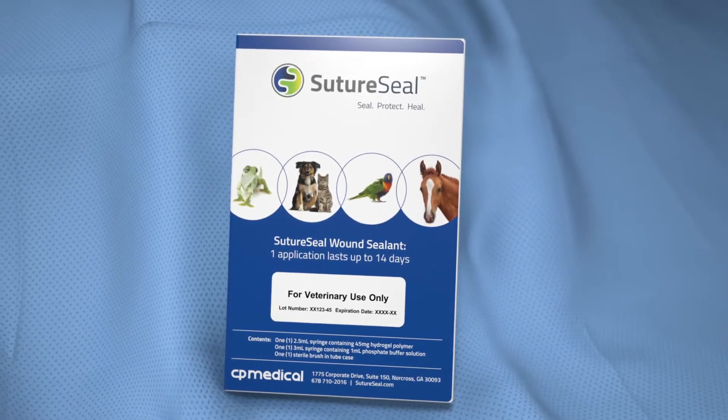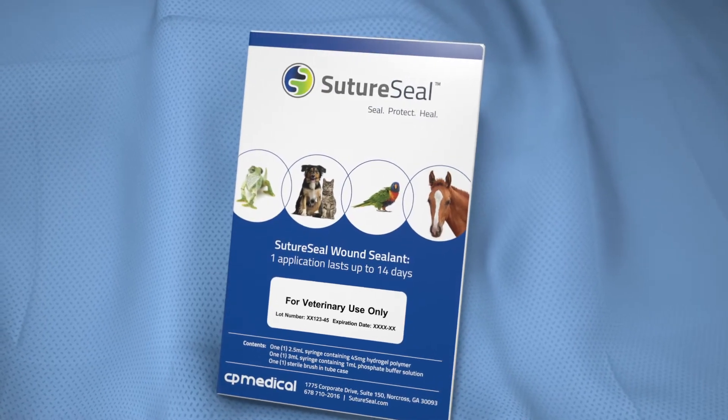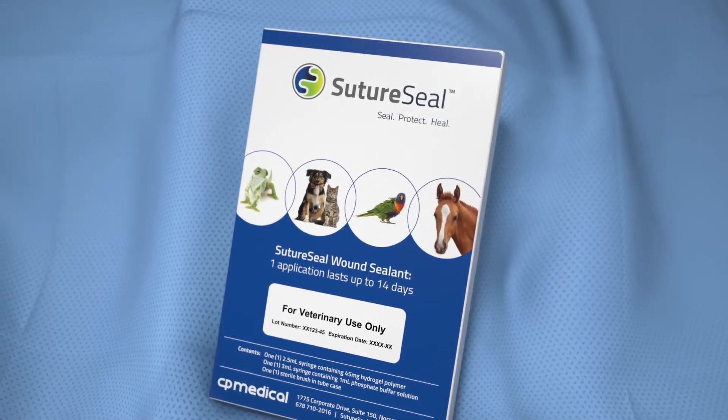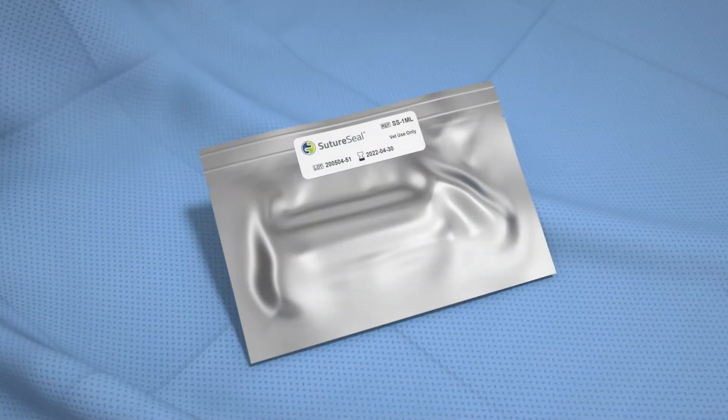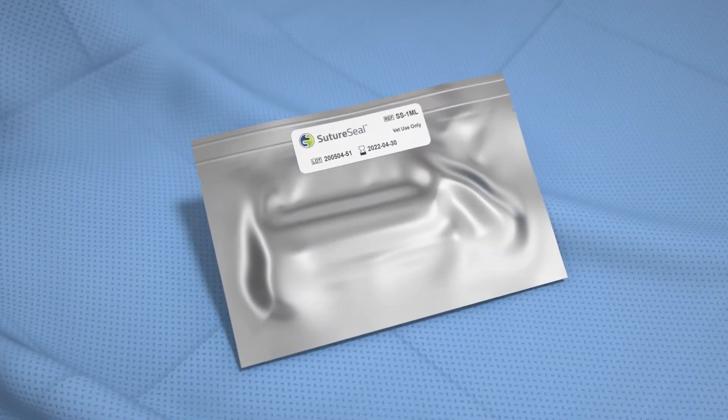Remember that refrigeration of SutureSeal is recommended if the product you have received is not used within five days of receipt. Remove SutureSeal from refrigeration 10 minutes before mixing the contents for ideal product application. It is recommended that SutureSeal be applied at room temperature.